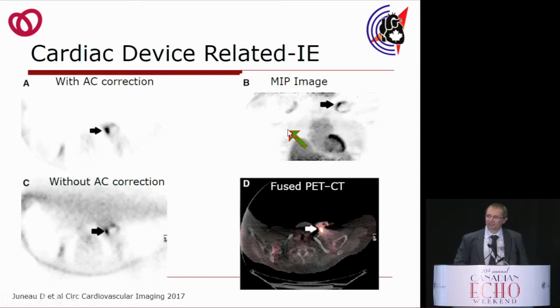Now, I know my colleagues will tell me if I don't mention this, but one of the issues with nuclear medicine is attenuation, or blockage, if you like, of the gamma photons on the way out of the patient towards the camera. So we have algorithms in our reconstruction to account for these lost photons, and it's called attenuation correction.